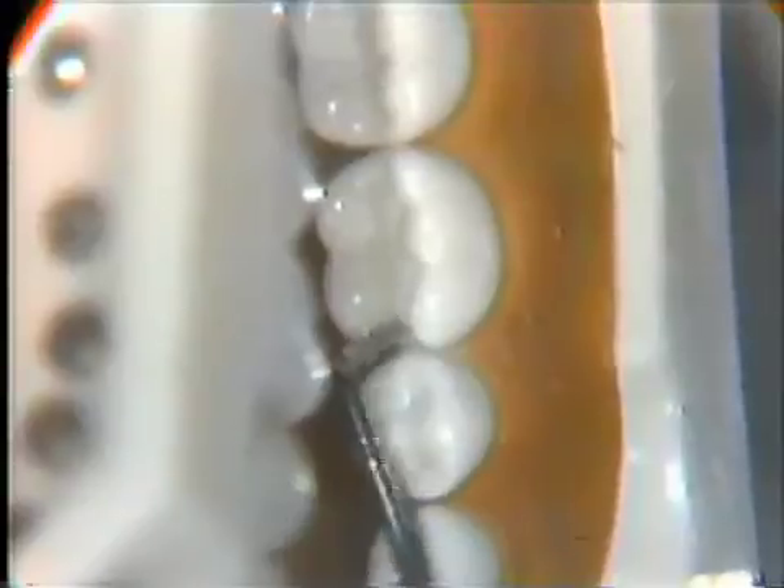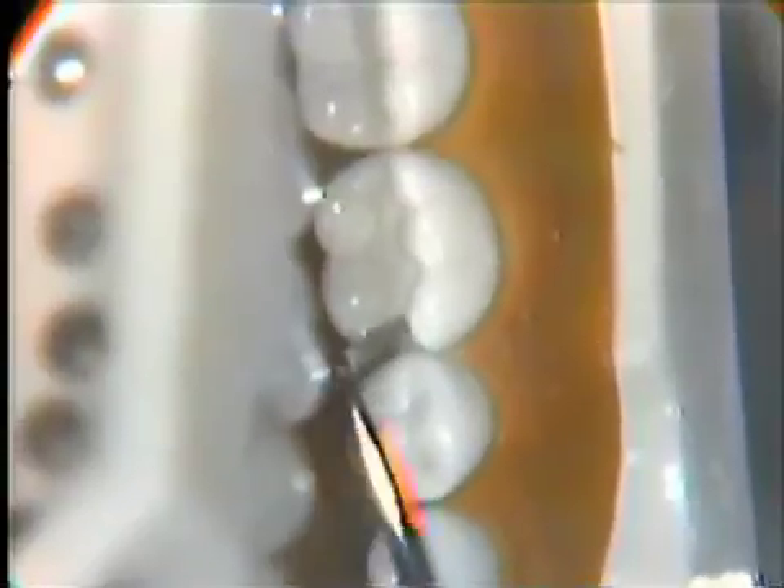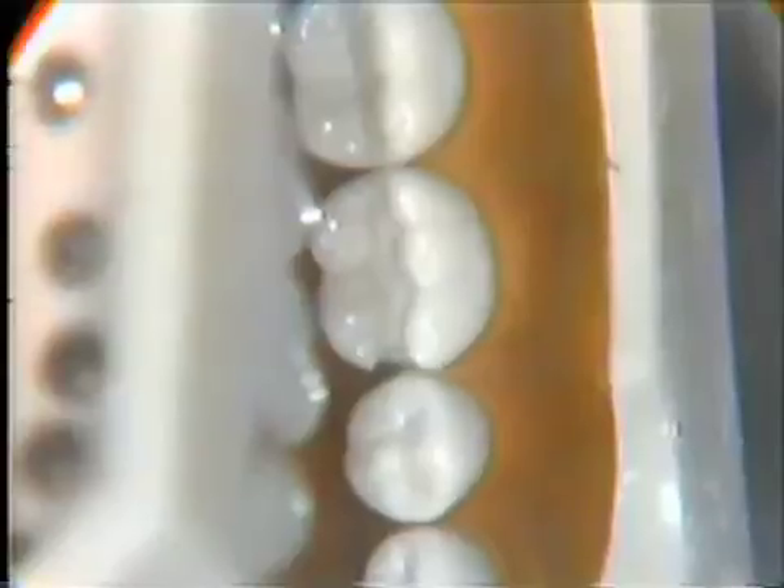With this same instrument, as we see on camera, we will round over or blunt the axial pulpal line angle, which was sharp and angular. And this would complete a practical sequence of hand cutting instruments refining the proximal of a Class II on tooth number 19 amalgam preparation.